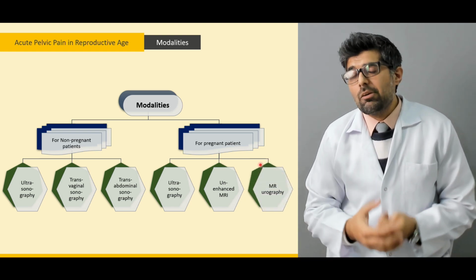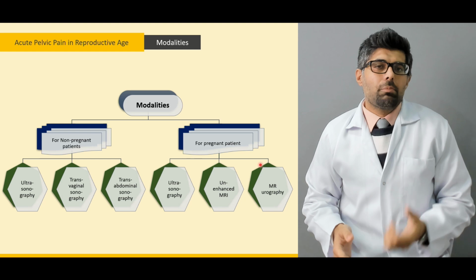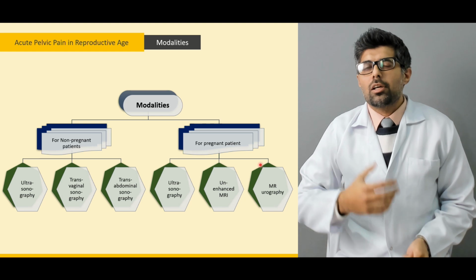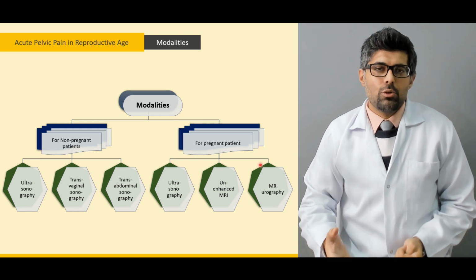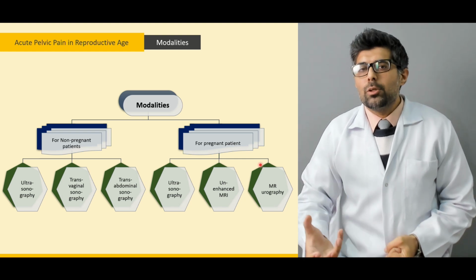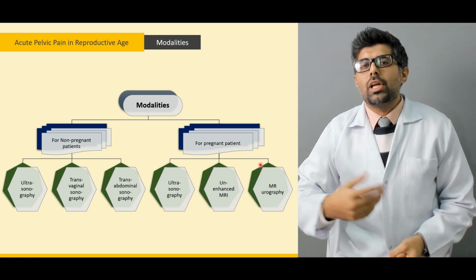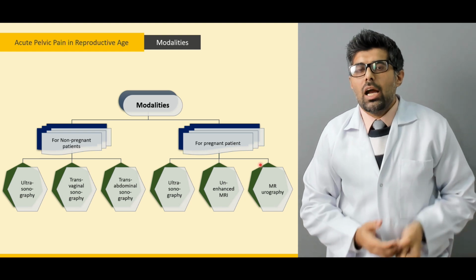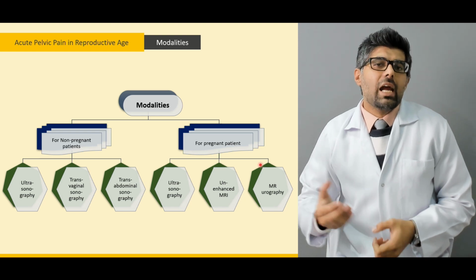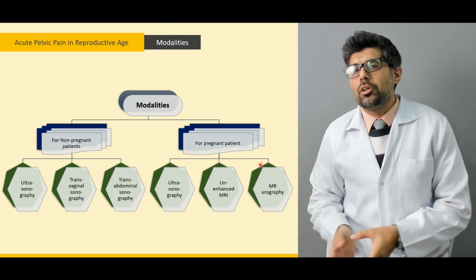Another modality that we use is the MR urography. Now, you might recall from my previous lecture that magnetic resonance urography is like a more advanced form of the IVU, or the intravenous urography. In that, we introduce a contrast media inside a patient and then we take a series of radiographs, and according to those radiographs we see both the patency and the filling of the urinary system.